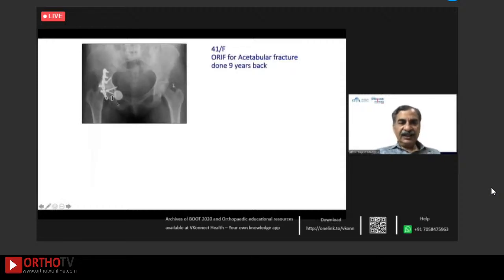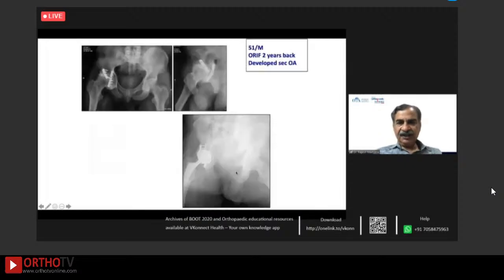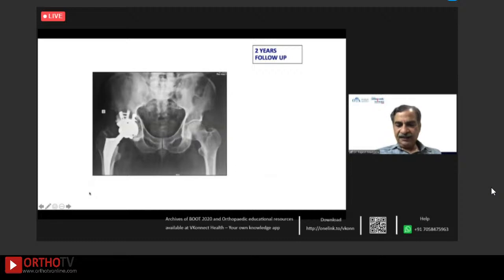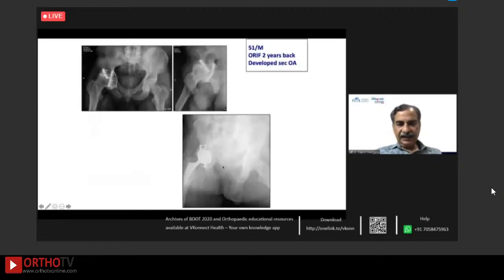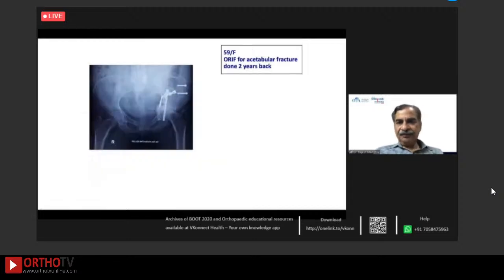Another example, you see these two screws, 41-year-old female, 9 years back, the fixation was done. And you can see this one screw needed removal, but then we let everything else be where it is. 51-year-old male, 2 years back, ORIF, developed secondary osteoarthritis. And you can see the inferior screws had to be removed. And that's the follow-up x-ray.